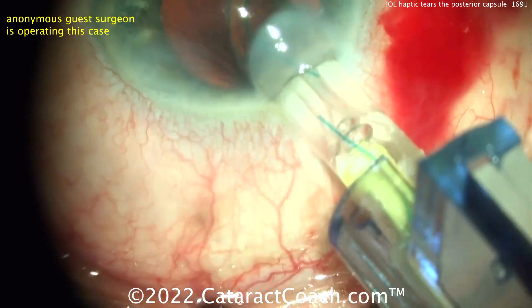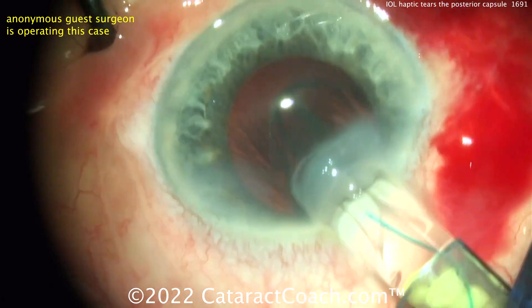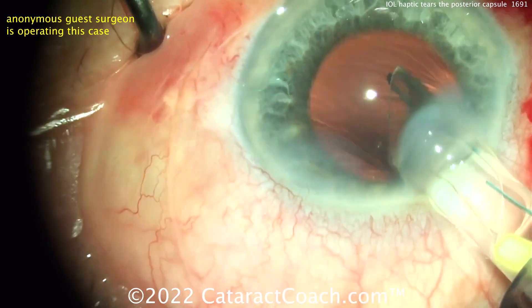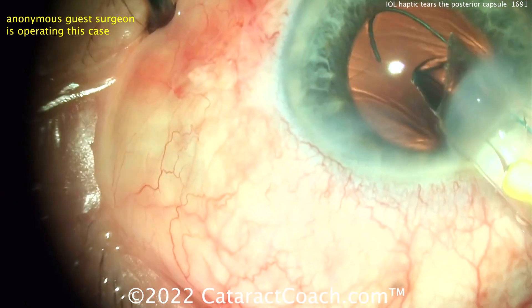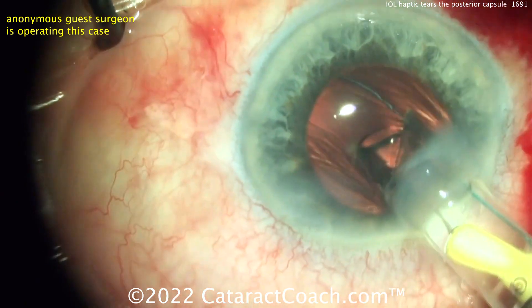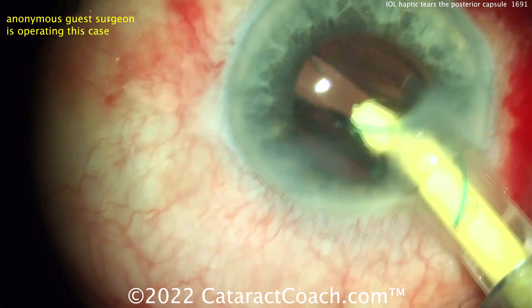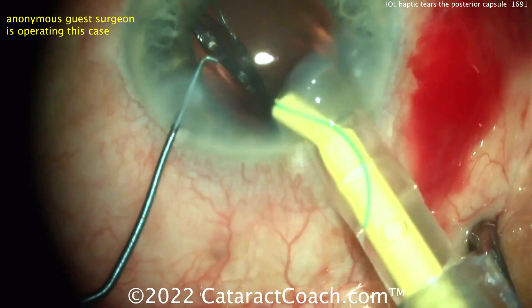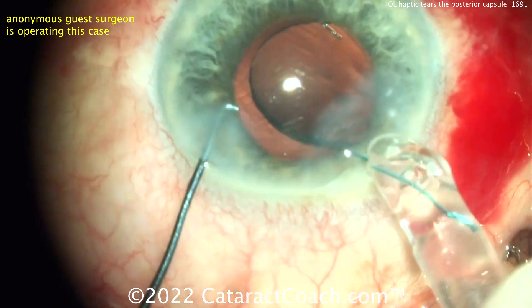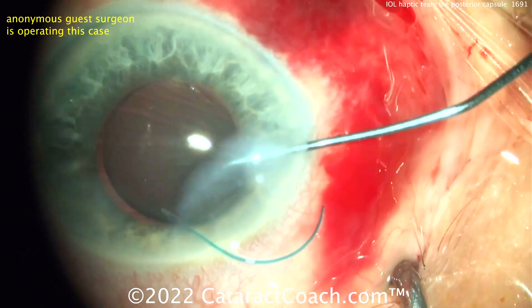Here's a three-piece lens going in. Watch carefully — there's the first haptic. Trying to rotate it around, and there's that haptic point getting right into the posterior capsule. There you go — now you did it. The eye is such a beautiful but fragile organ that anything can cause an issue.